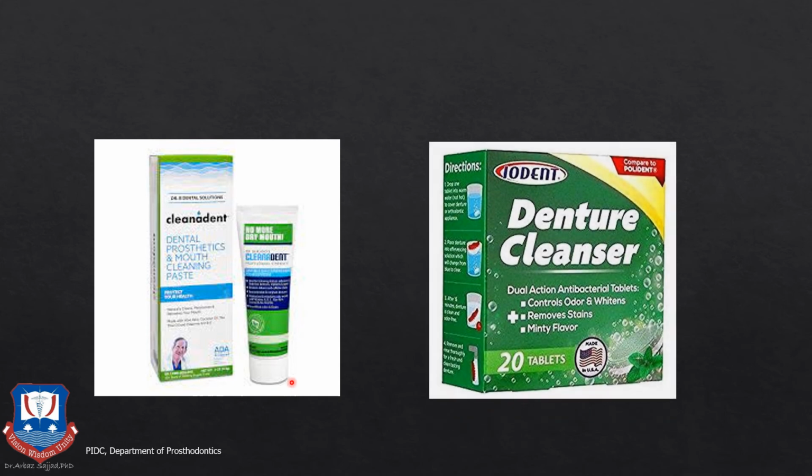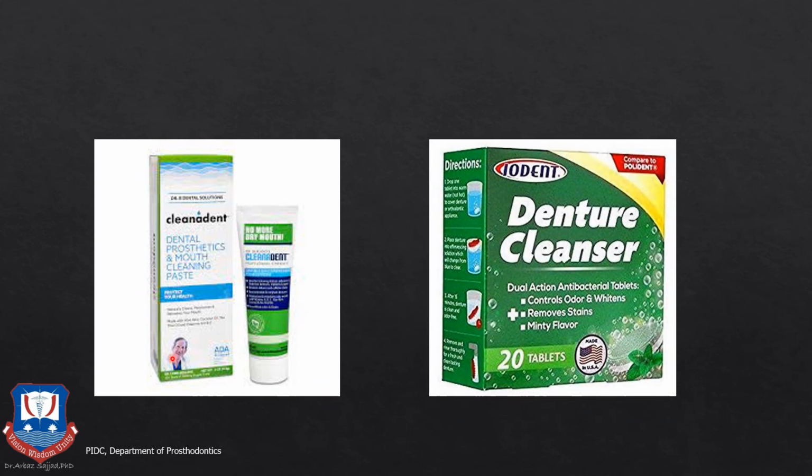So these are the cleaning products that the patient should use. A denture cleaning paste, just like toothpaste, to clean the denture, and denture cleaning tablets, which are used by putting the denture in water, and a tablet is put into the water in which the denture is placed. Usually, keeping the dentures in this denture cleansing solution for 20 to 30 minutes is sufficient. The patient should be advised not to leave the denture overnight in this cleansing solution because it may bleach the color of the pink acrylic.